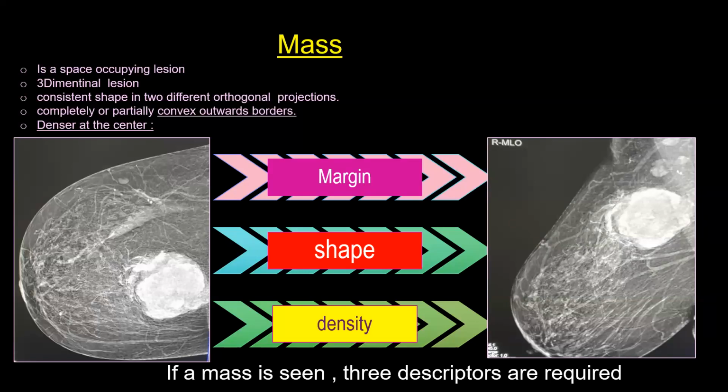Who said shape? He said one descriptor, he should define himself. It depends on you, suggest one, your approach. If you mean the most important, then I suggest the margin. Excellent, the margin is more important.